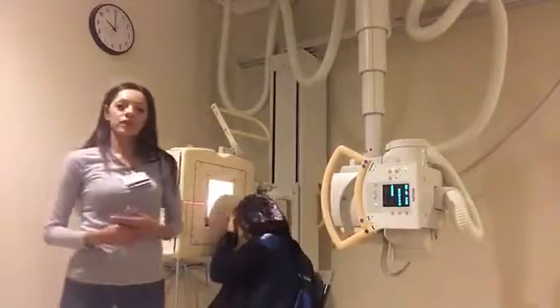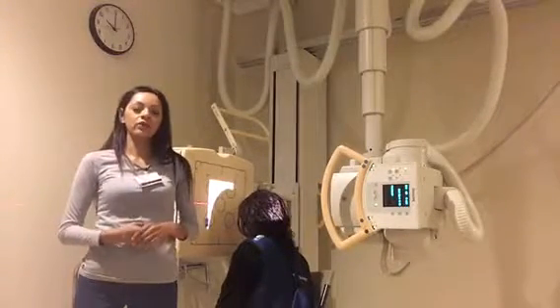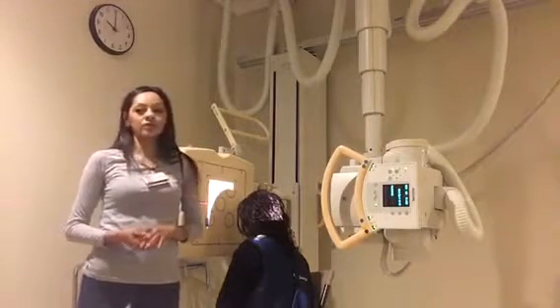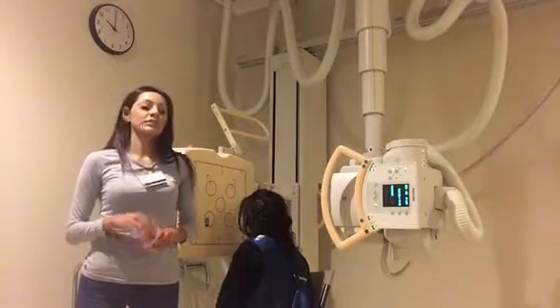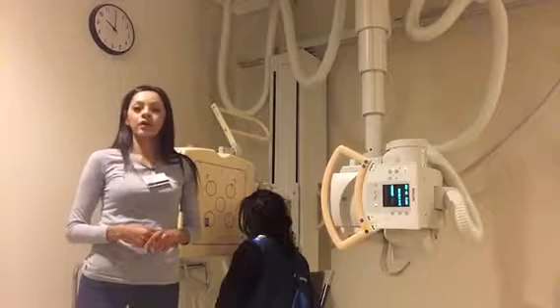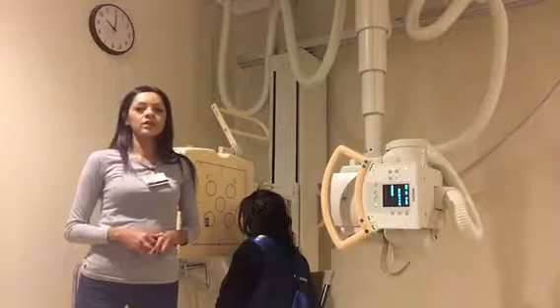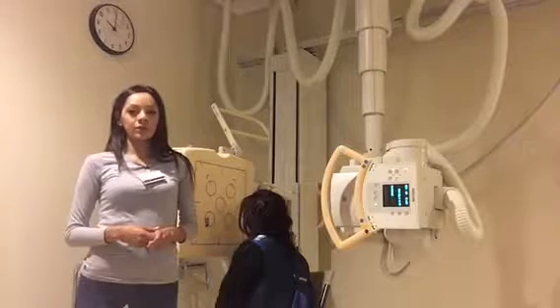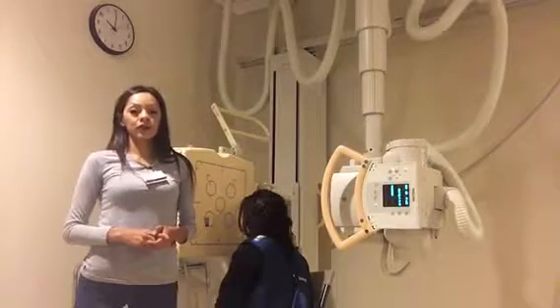And the next projection that I'm going to be doing is the parieto-acanthial Waters for the maxillary sinus. My central ray is going to be horizontal, exiting the acanthion. My chin is going to be on the bucky with the mid-sagittal plane perpendicular to the IR. The OML forms a 37-degree angle from the plane of the IR, and the MML is going to be perpendicular to the IR.